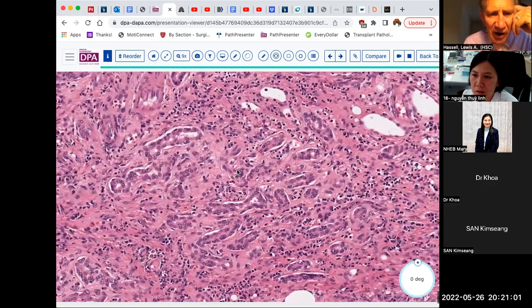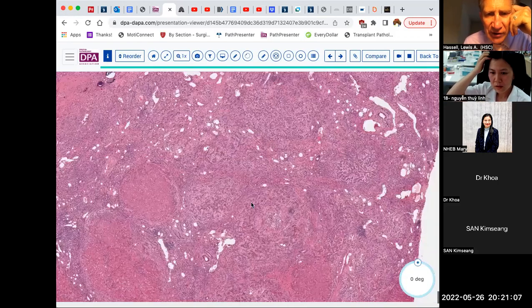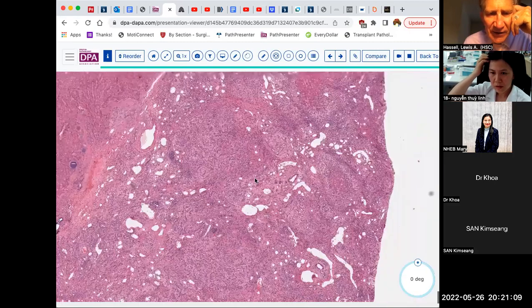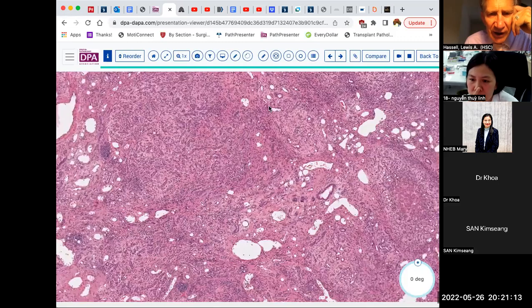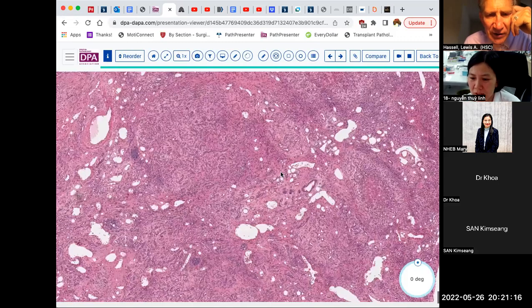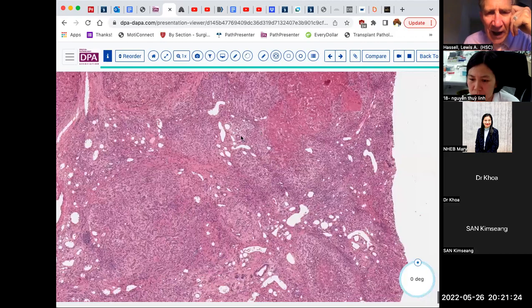But this is not carcinoma. This is the kind of bile duct proliferation that we get with cirrhosis and end stage changes due to cirrhosis. You'll see that there's a degree of nodularity to this. There's still some remaining architecture. And so those are features that say, I'm a reactive phenomenon rather than a neoplastic phenomenon.